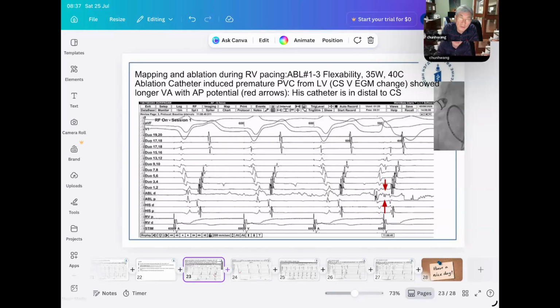They don't behave like an ectopic atrial rhythm, but often they can cause a PVC. They can also be the source of a PAC. So, for example, when you're ablating a tricuspid annular PVC, we believe that probably removes the primary ring pacemaking cells. Now, what happens when your accessory pathway involves that residual primary ring nodal-like cell? You're going to have decremental conduction. That's a potential explanation that we can offer you.